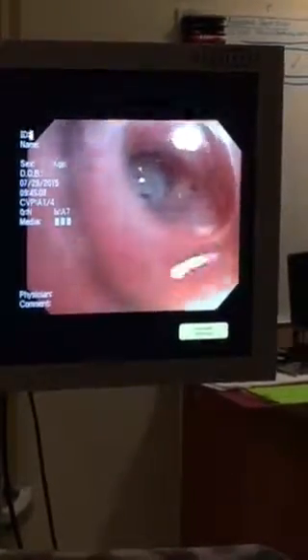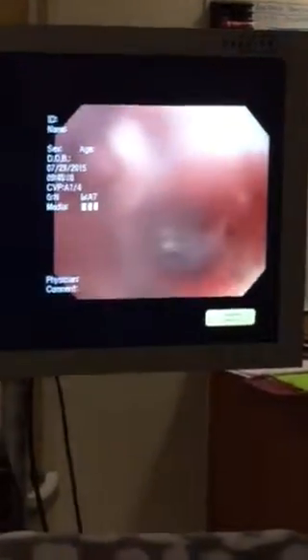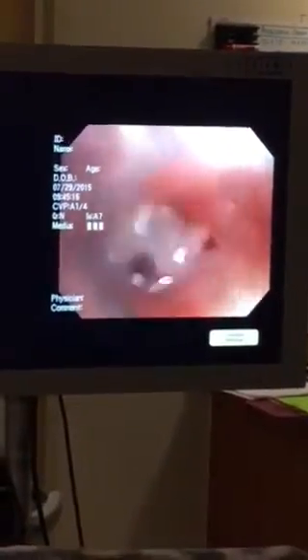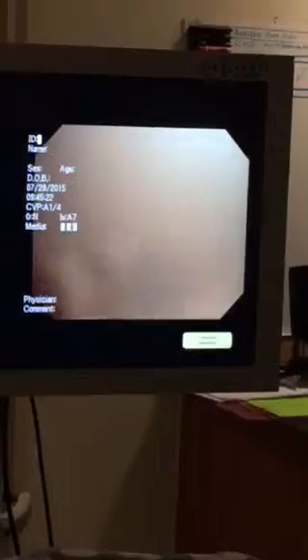Let's go ahead and lavage this area. Is this your right lower? Yeah. No, this is left lower. You're doing the left lower? This is one of the areas, remember that area I was showing you that was all matted up and kind of toward the lower middle? Yep. Oh, what's going on? On the left side. This is the area I'm in now. Left lower lobe.